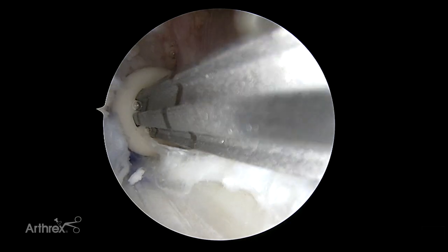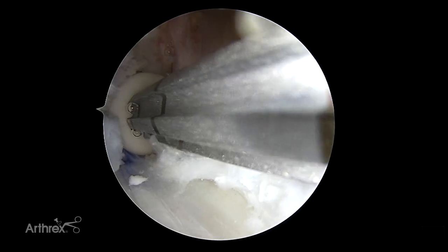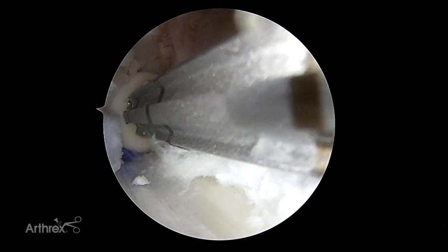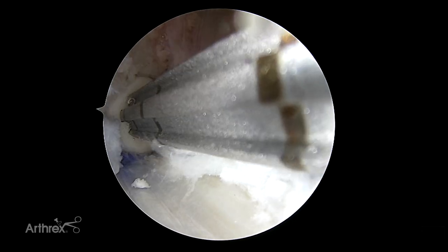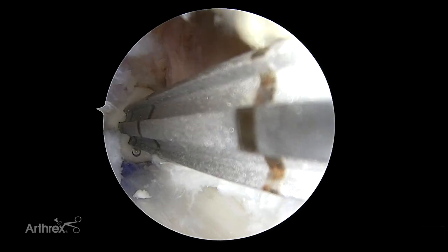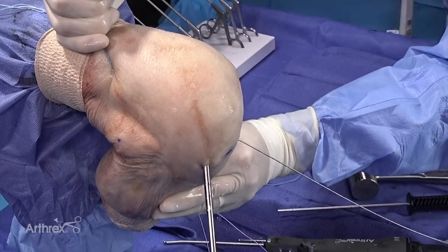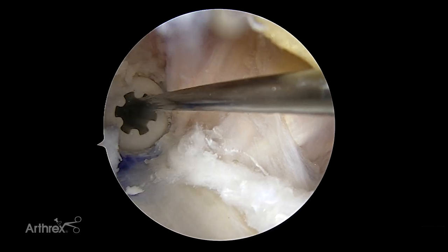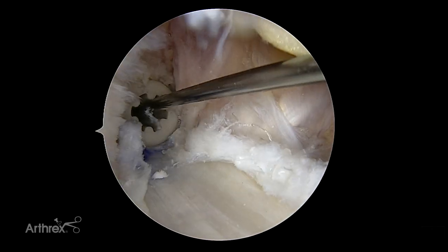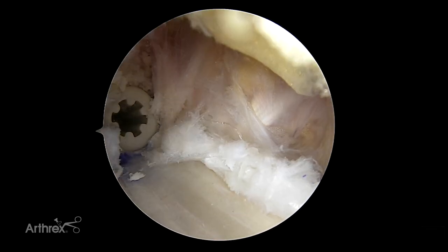As we get close to fully seated, this is a reasonable time to remove your guide wire. We eliminate some of that concern because we know it's only been advanced 8 to 10 millimeters beyond the end of the dilator. When we're comfortable that we're fixed and collinear with the notch, we remove the screwdriver. You get a nice view showing you're on the safe side of the graft — we had marked that purple interface — with nice interference aperture fixation. The wire can then simply be removed.